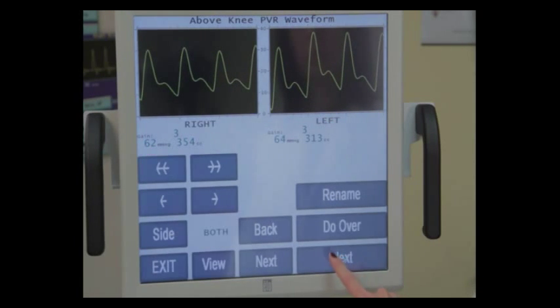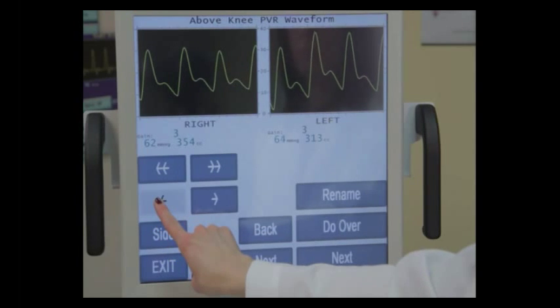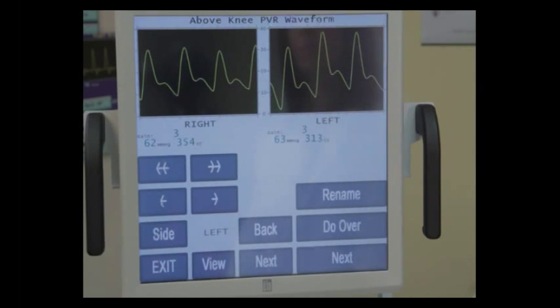We're going to wait for these to stabilize and press the capture button when we're happy. And we will scroll the left waveform again independently until we have 3 nice consistent waveforms. We're going to press next.